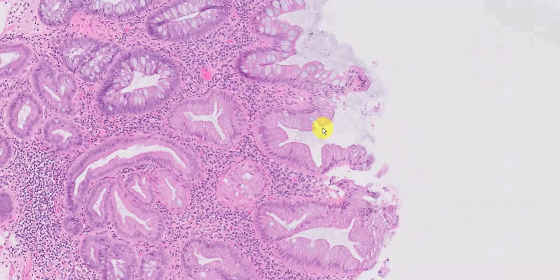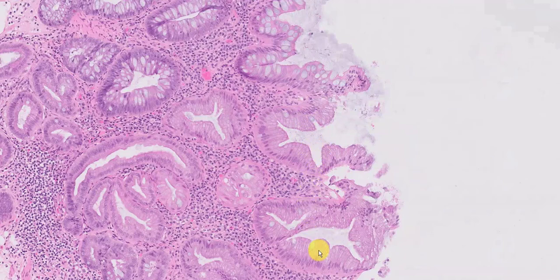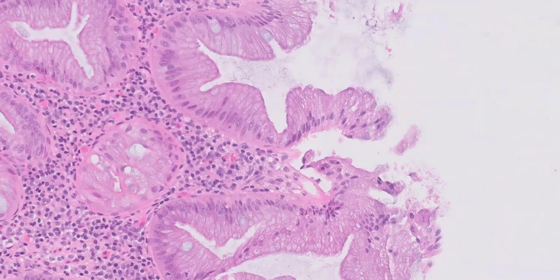What do I mean by star-shaped profile? That's exactly what I mean — doesn't that look a little like a star? And depending on how the polyp is cut, you'll see the sawtooth-like profiles. And that is what is meant by a serrated profile.